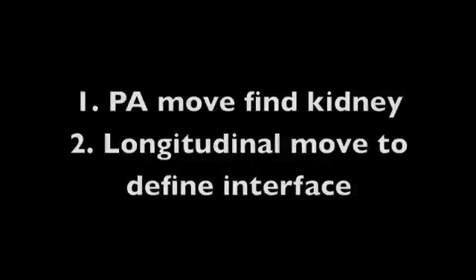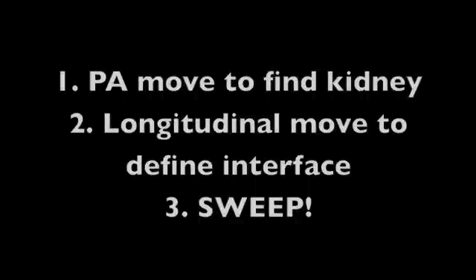To review: first you'll make a PA move to make the kidney look as big as possible. Next, you'll make a longitudinal move to see the entire interface. Then you'll very slowly sweep the entire interface. You might have to do several overlapping sweeps at different positions in the longitudinal plane if you can't see the entire interface in one view because of the rib shadows.